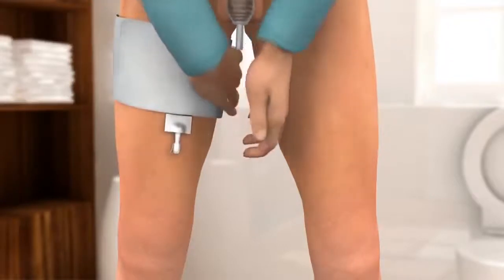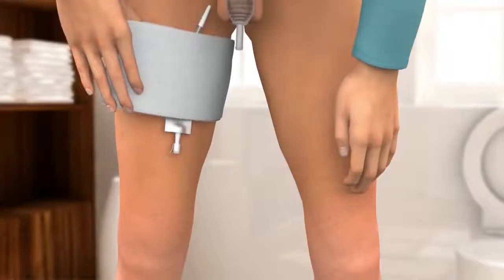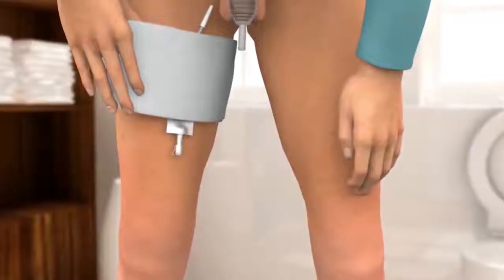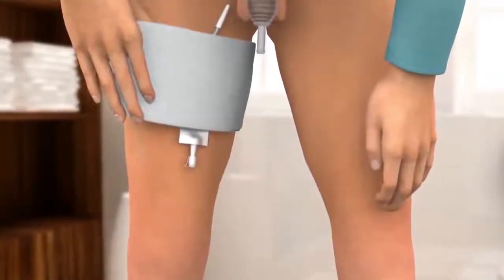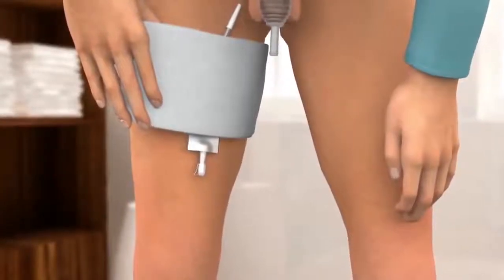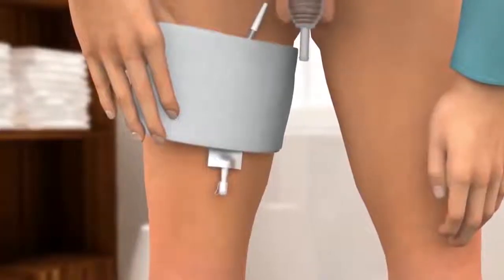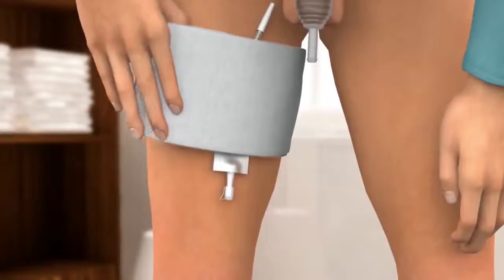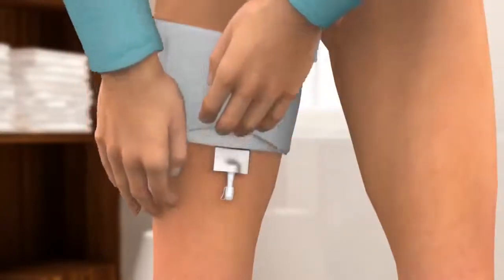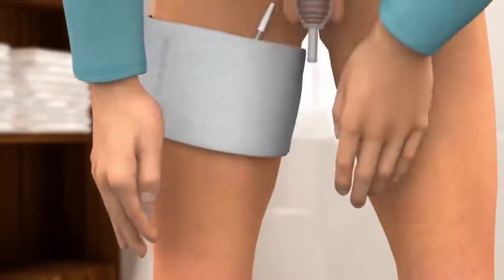Attach the bag directly to the skin of your inner right thigh. Wrap the long section of strap around your leg and use the burr fabric to fasten the strap. The fit should be comfortable and firm, not too tight. You may need to reposition the bag a few times to discover the best position for you. For comfortable wear and discretion, hide the outlet tap by folding it upwards and tucking it into the pocket between the bag and the outer elastic layer.